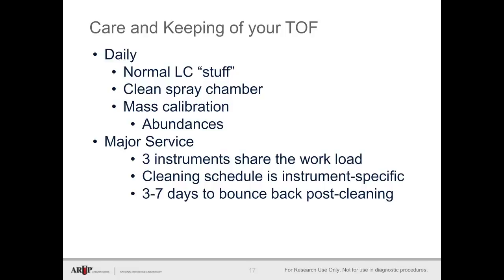The key is paying attention to changes in your system and being proactive. Have a set of criteria for when your instrument needs service. Area counts are the biggest indicator.